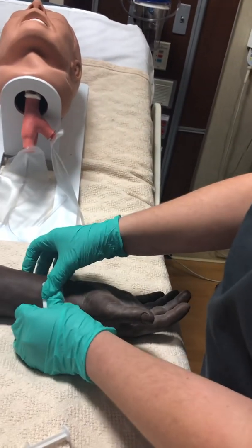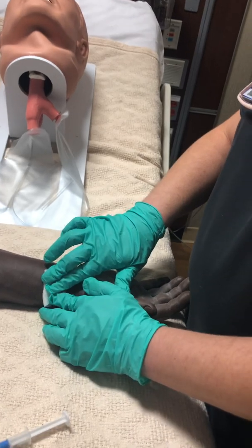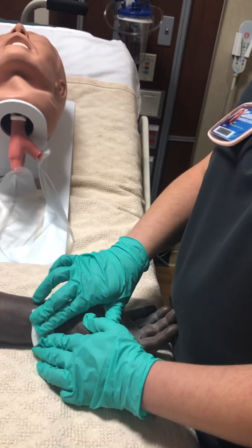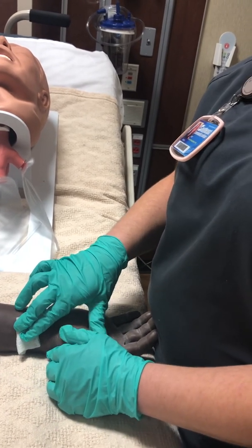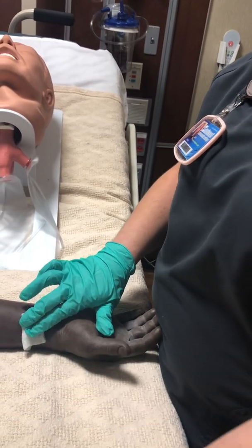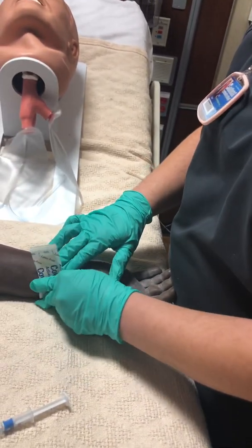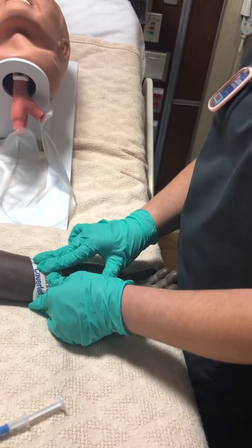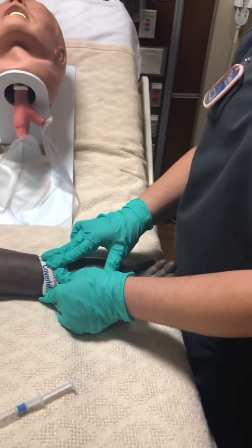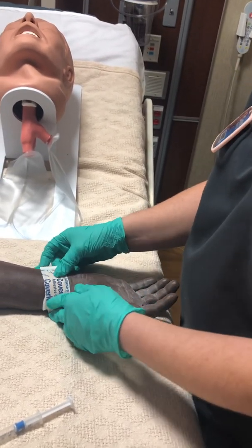When I am done, I need to hold the site for at least 5 minutes. If they're on an anticoagulant or any kind of blood thinner, I need to hold more than 10 minutes, because I don't want them to bleed out while I am doing everything. I place the Band-Aid on, and I let the patient know they need to leave it on for at least 4 hours, so that we don't have any bleeding.